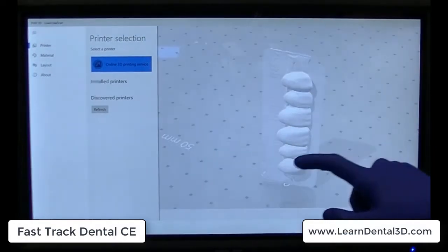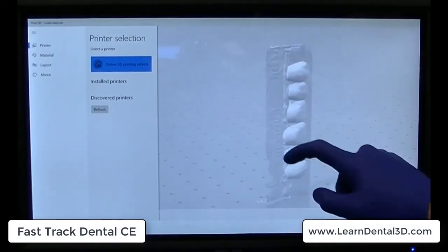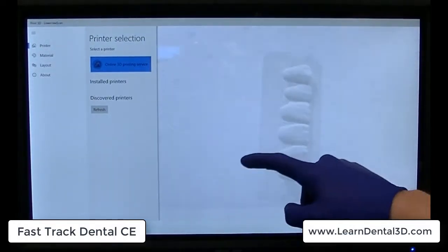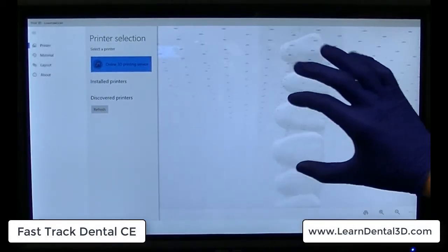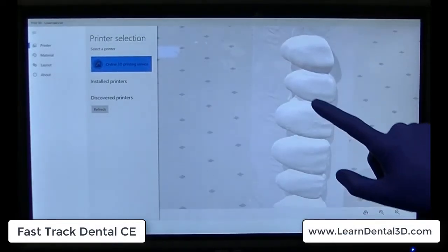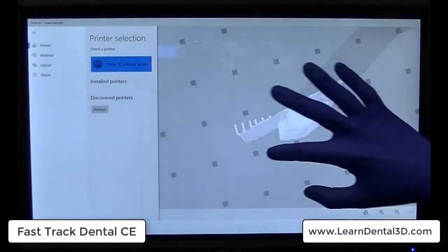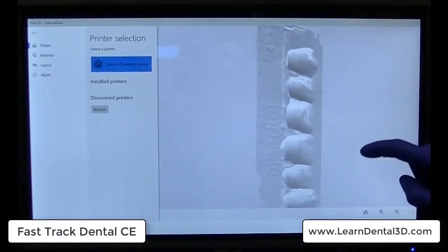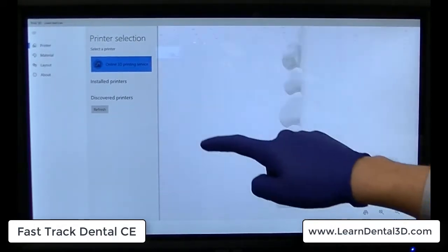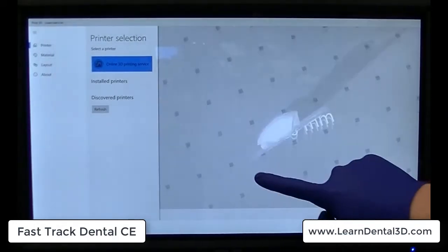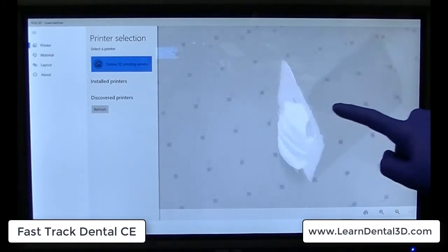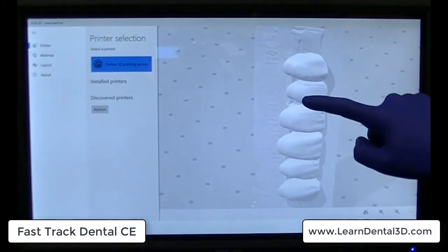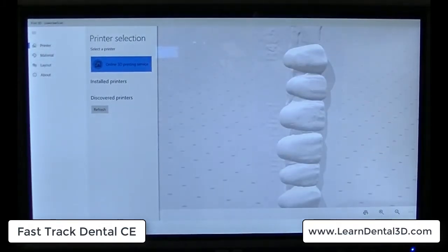We can then go ahead and take that file and turn it into an open STL. The open STL is now free for us to use in whatever fashion we wanted to use it in. Sending it to ourselves, now we can go ahead and utilize it in creative methods.